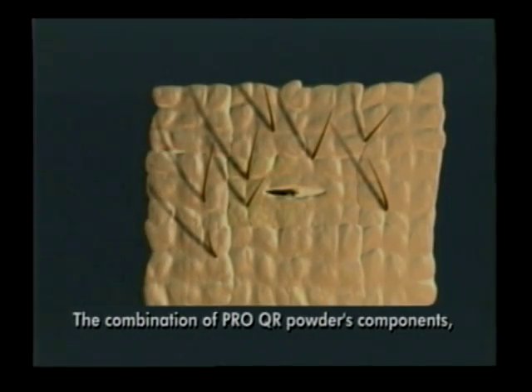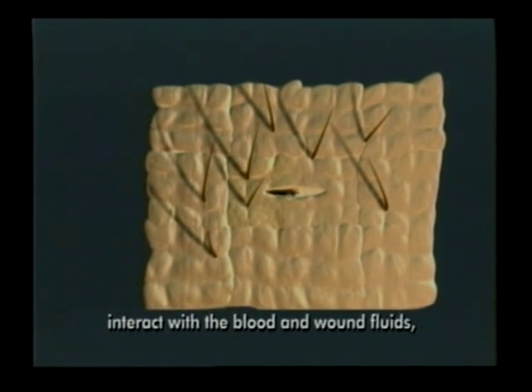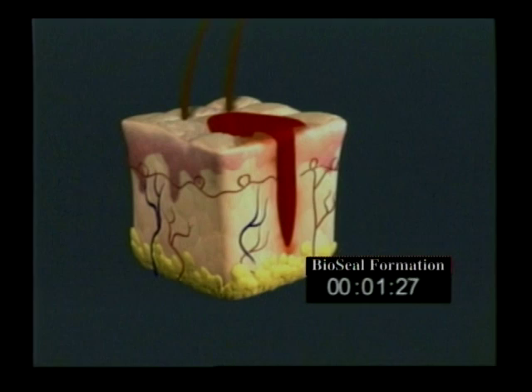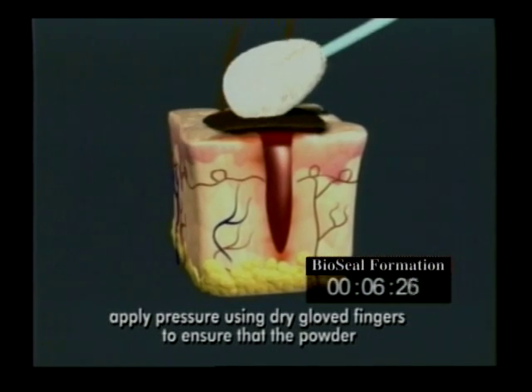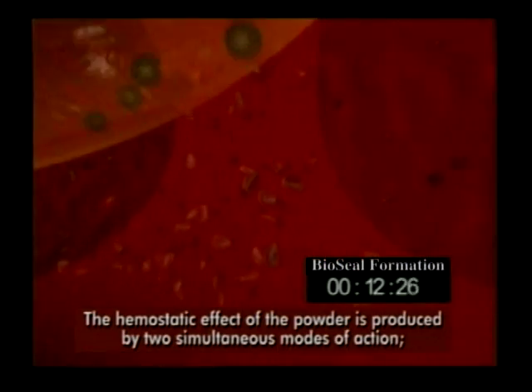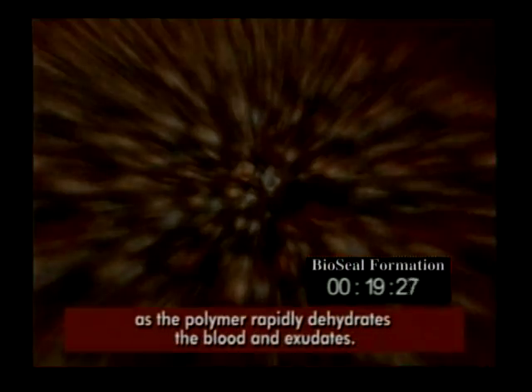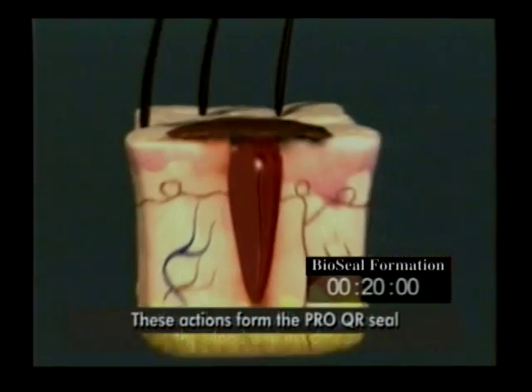The powder ingredients in BioSeal Advanced, formerly known as ProQR, are potassium ferrate and a hydrophilic polymer. The mechanism of action is a simultaneous two-step action whereby the hydrophilic polymer rapidly dehydrates the blood, while the potassium ferrate binds with the blood proteins to create an occlusive seal. This seal functions as a microbial barrier helping to protect the patient from infection. BioSeal works independently of the clotting cascade, so it's highly effective for patients with bleeding disorders or those on antiplatelet or anticoagulant therapy.